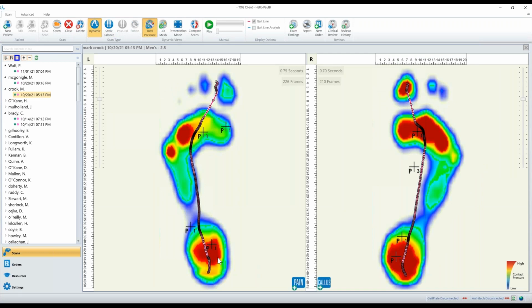Very often you just show it to them very quickly, and they'll ask what's happening with my feet. Do I need a pair of orthotics? This can be done after 2 or 3 appointments, but it's certainly something you would then introduce into the treatment plan.